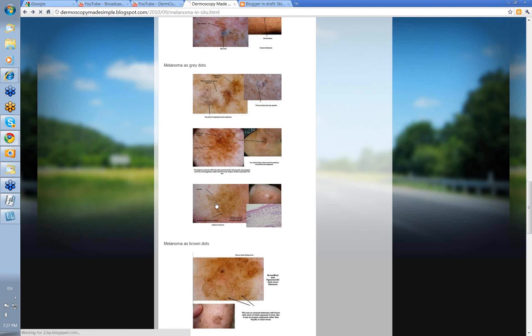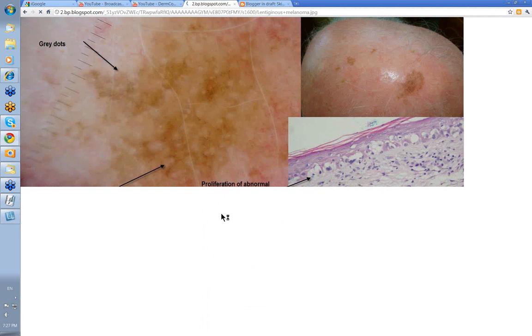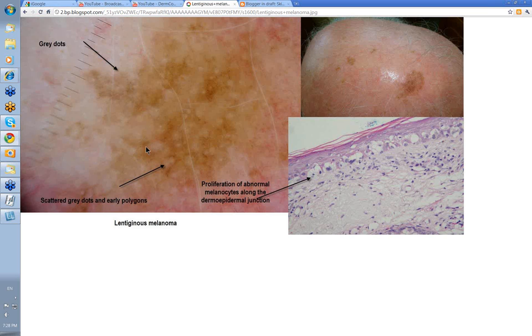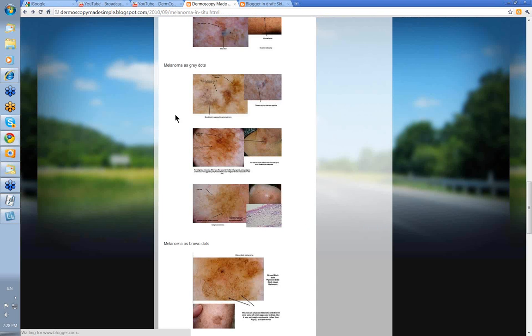Here's another one on the scalp. There were two lesions — this was a simple lentigo, and this was actually an invasive melanoma in a small part, but the vast majority of it was a lentiginous melanoma. Scattered grey dots down here, scattered grey dots up here. I think there's some early polygons but I may be imagining it with this one because I know the diagnosis. But certainly lentiginous proliferation of abnormal melanocytes. Fairly subtle lesion dermatoscopically, but the grey dots help you and any early polygons help you as well in these lesions.